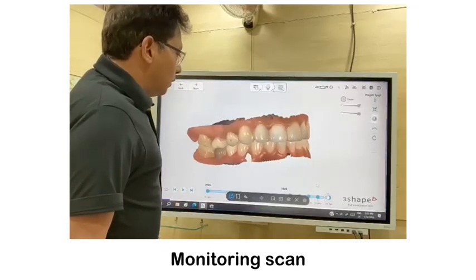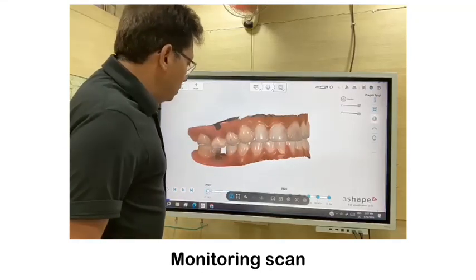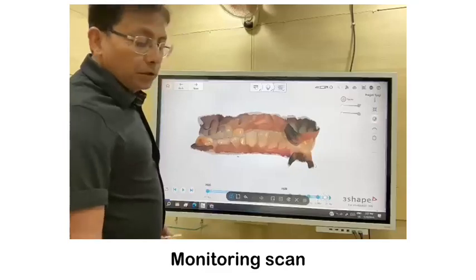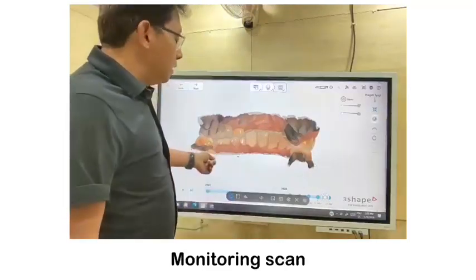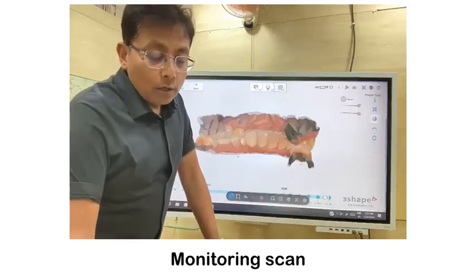But it is multiple. So this has gone through multiple phases, one, then second, then third, fourth, fifth and sixth stage, and we finished off the treatment. So canine guided occlusion is a balanced occlusion where interference is free and occlusal locks are treated.